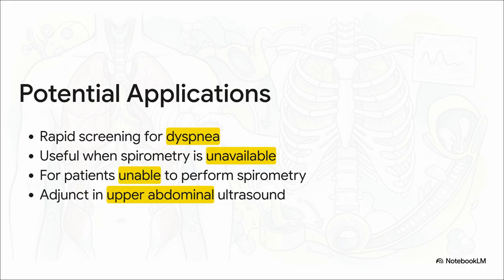It's a game changer when spirometry isn't available, or for patients who just can't do the maneuver. Maybe they're too weak or confused. You could even pick it up as an incidental finding on a FAST exam or a gallbladder scan.